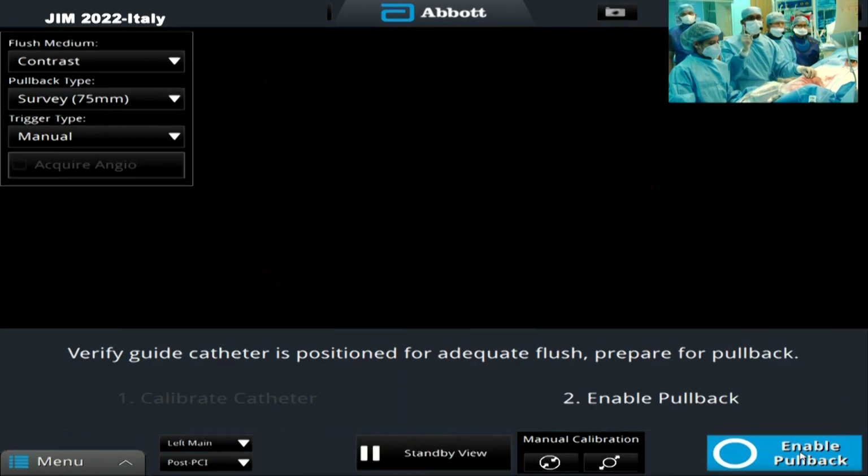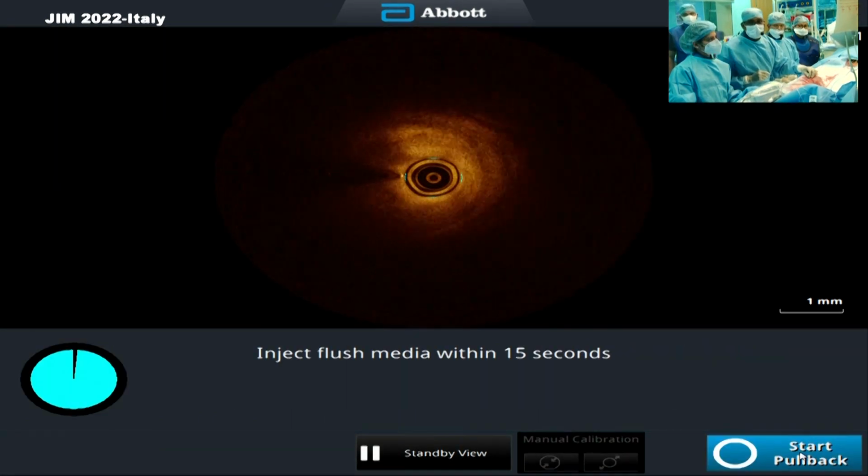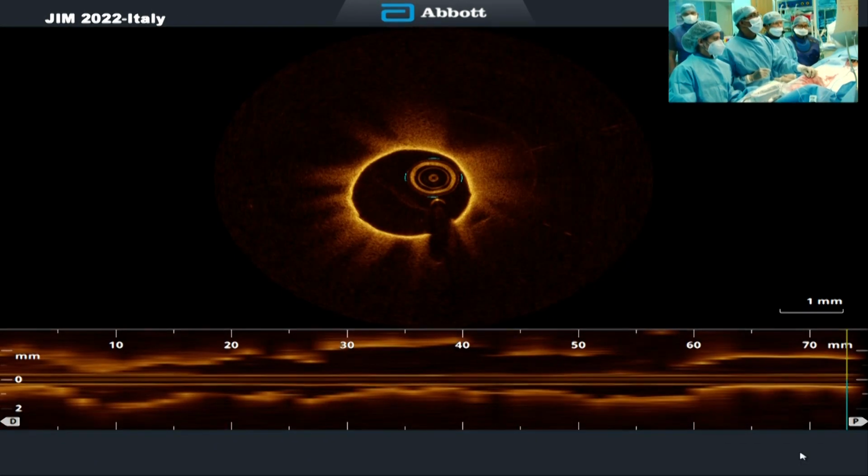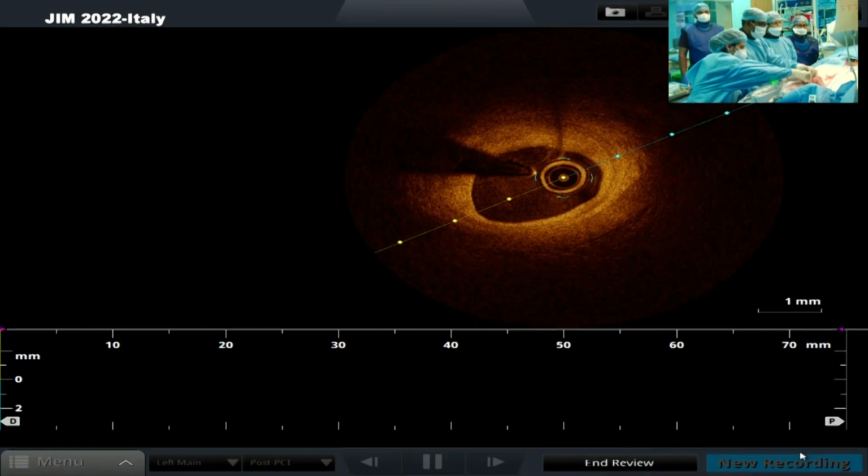I'll say inject and activate. Okay, so please go ahead. Okay, good. We have exactly three minutes and fifteen seconds. Tremendous. Okay, beautiful. I can see it. It was all good.